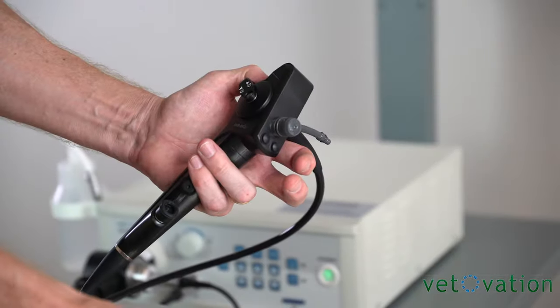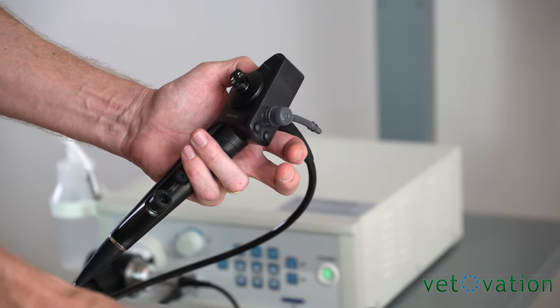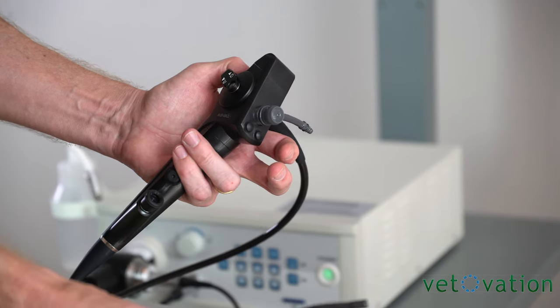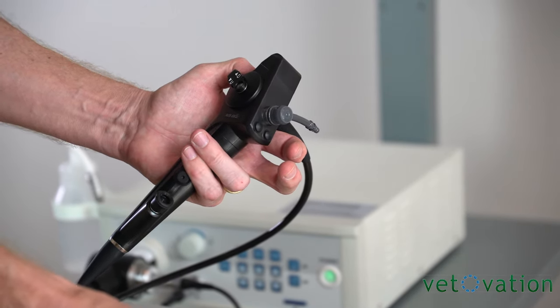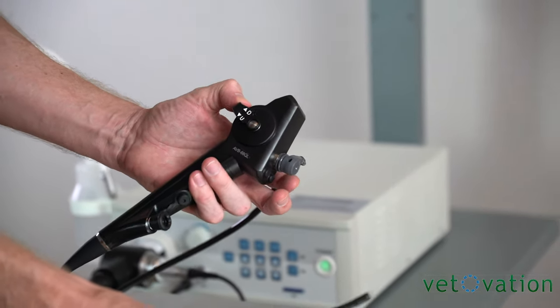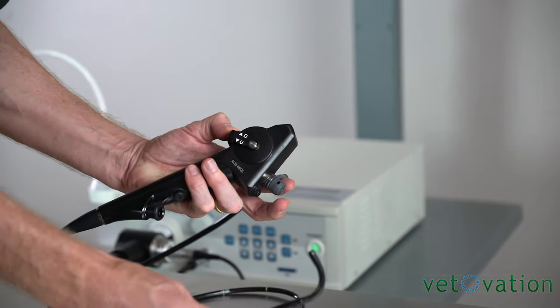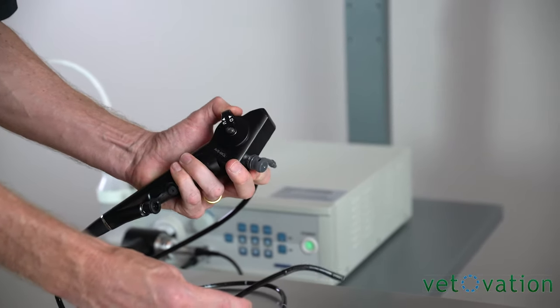The flexible rhinoscope, cystoscope, bronchoscope is one meter in length and 5.8 millimeters in outer diameter with a two millimeter working port. The tip of the retroflexion of the scope is controlled with the dial here so you can move it back and forth.